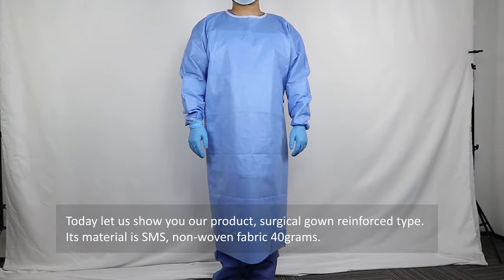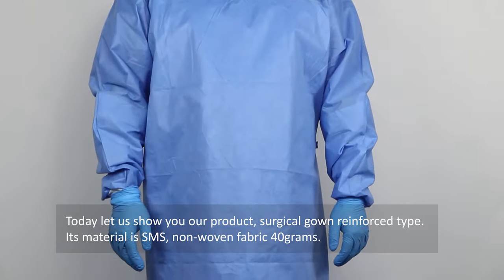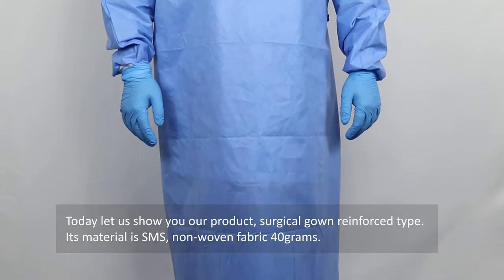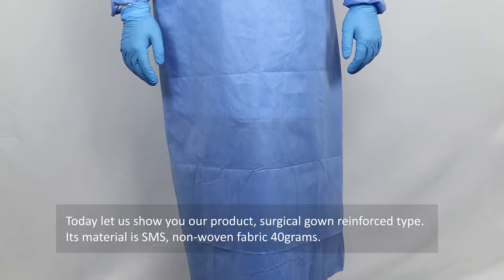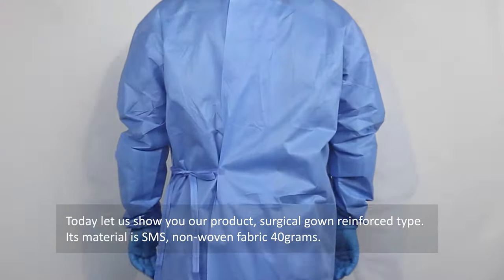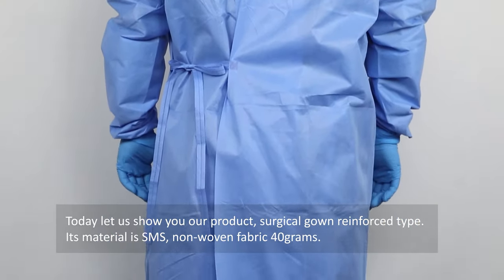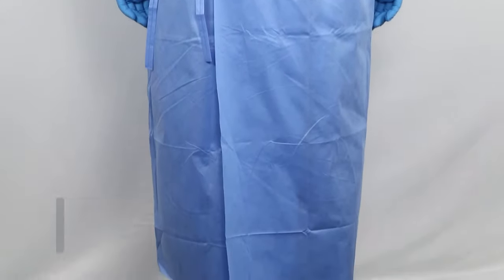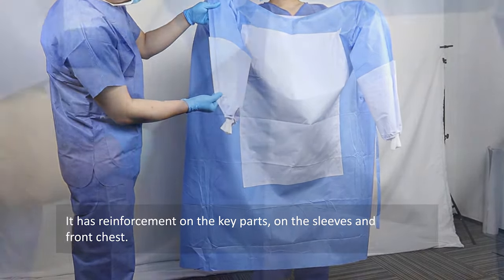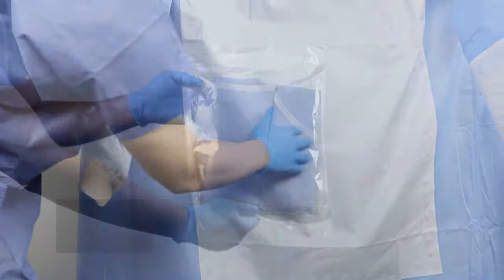Today let us show you our product: surgical gown, reinforced type. Its material is SMS non-woven fabric, 40 grams. It has reinforcement on the key parts — on the sleeves and front chest.